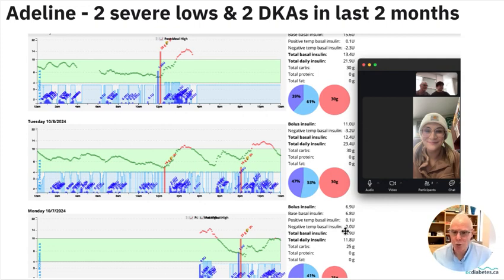And we did daily calls with her, and you can see here's the installation here, and her time in range over the first 2 days is, I think, 85%. And I can tell you that since then she's also done well. So a bit of a gamble on my part. When I think about the dangers of Loop, I say to myself, it's better than the alternative. The alternative is absolute chaos. If we reduce the chaos just a bit, we've helped.